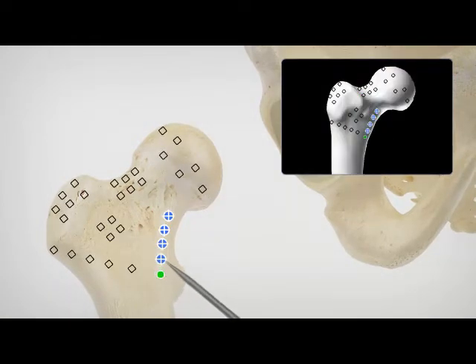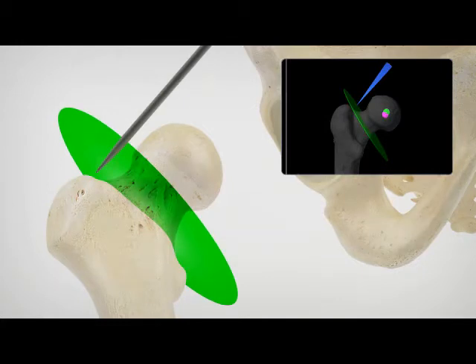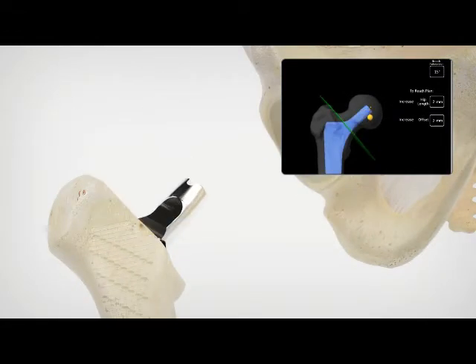During surgery, the patient's unique hip joint is registered and aligned to the preoperative plan. The surgeon plans and accurately defines the level of the femoral neck resection in order to achieve ideal leg length restoration. Once the head of the femur has been removed, the femoral canal is prepared using broaching instruments.